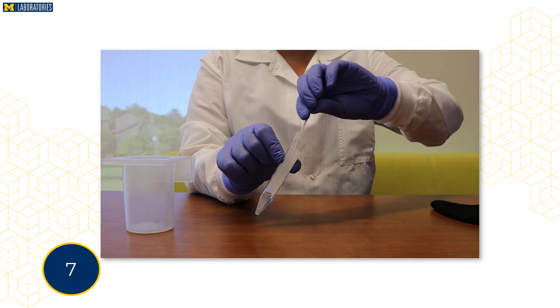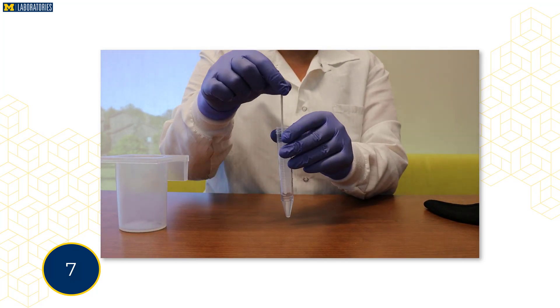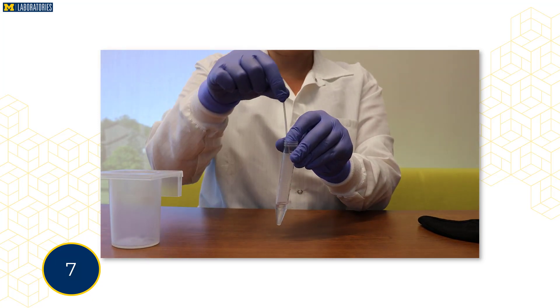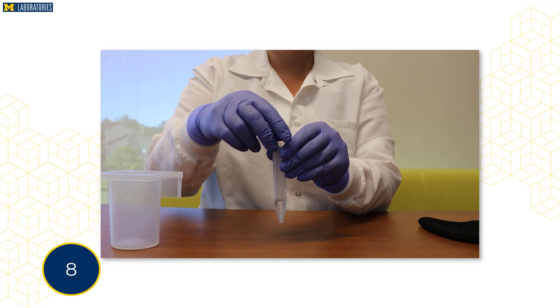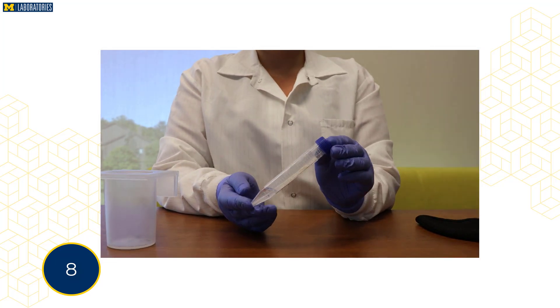Lower the tip of the swab into the tube. Once the swab tip is submerged into the liquid, break the swab handle at the breakpoint of the swab by bending it back and forth. Securely fasten the cap onto the tube and hand it to the collection personnel for proper labeling and packaging.